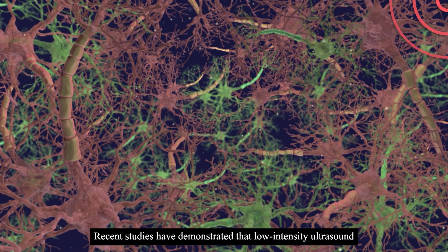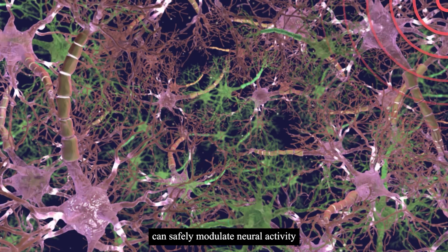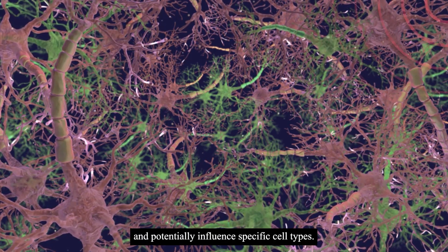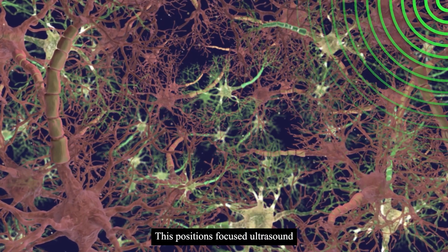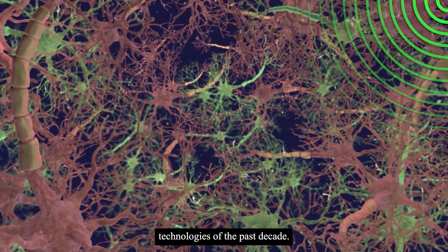Recent studies have demonstrated that low-intensity ultrasound can safely modulate neural activity with high spatial resolution and potentially influence specific cell types. This positions focused ultrasound as one of the most promising precision neuromodulatory technologies of the past decade.